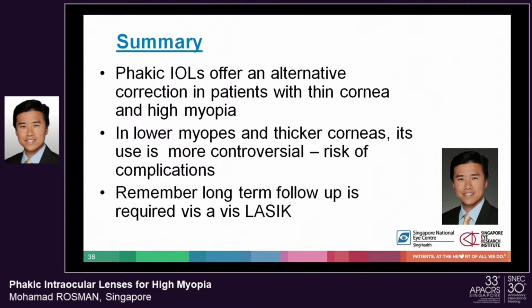It is controversial because of its risk of complications. However, I think it's important to understand that for phakic intraocular lenses, long-term follow-up is required compared to LASIK. Thank you very much.